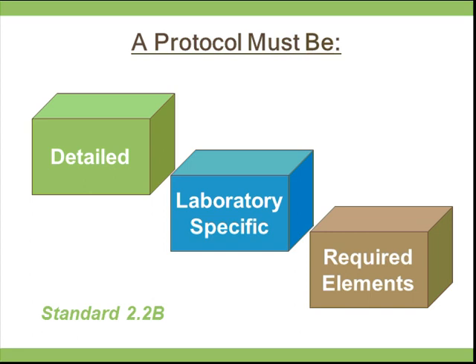Consistency in how imaging studies are performed is very important, considering that patients often have serial studies, such as when patients have PET scans to detect tumor reoccurrence. If a patient had a study last year and a follow-up study this year, differences in the results should be due to changes in their clinical scenario and not as a result of changes in the technical performance or quality of the study.